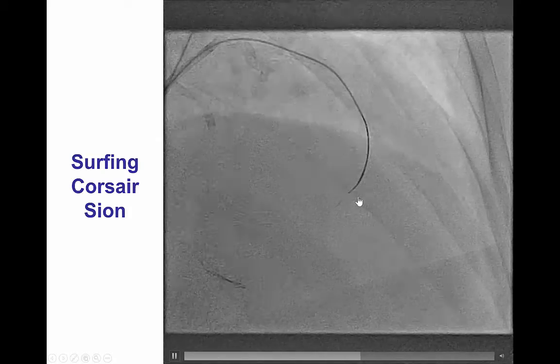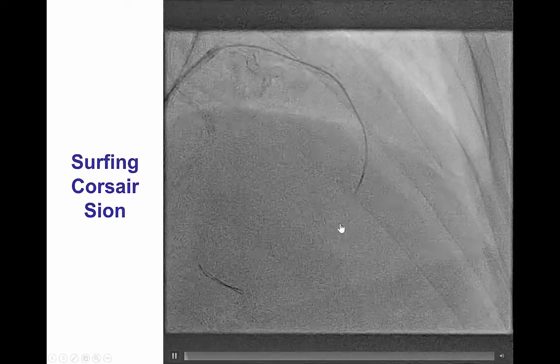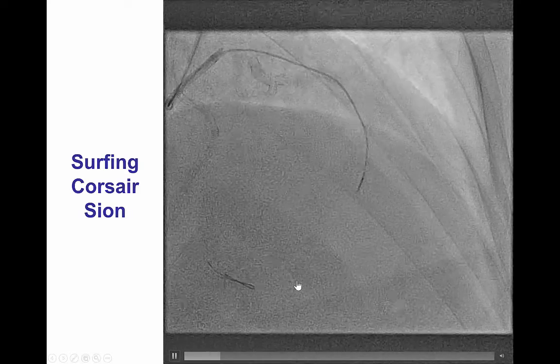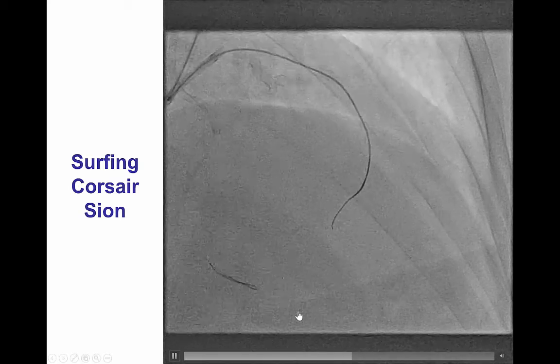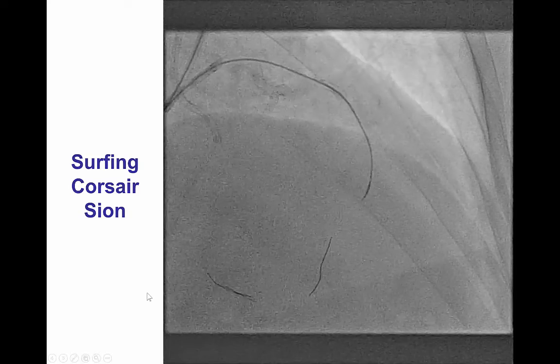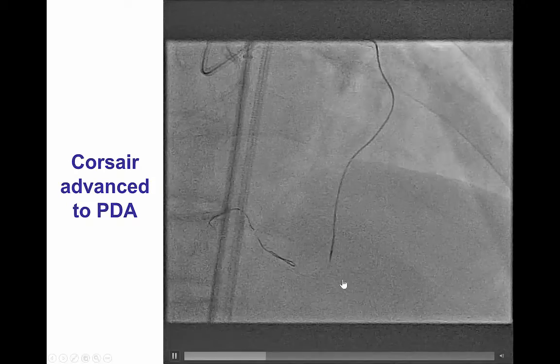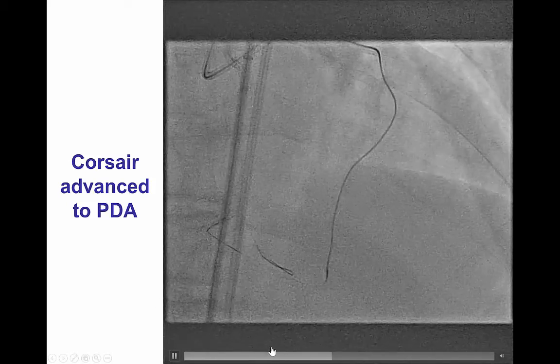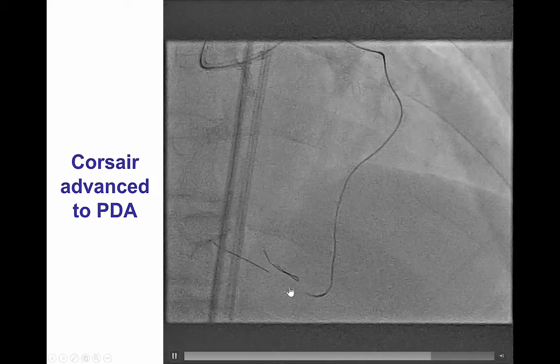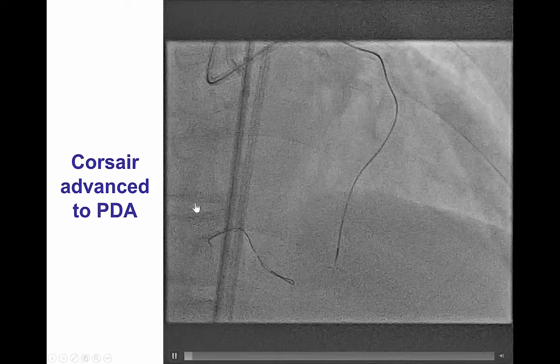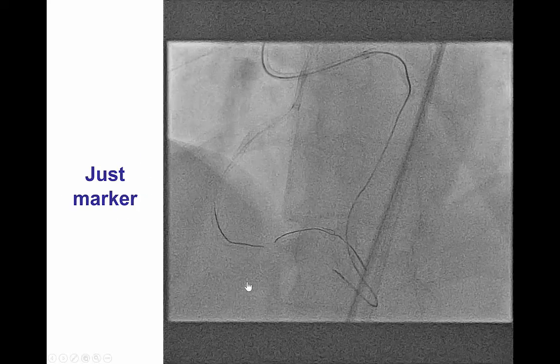This is an example of advancing through a Corsair microcatheter into the septal branch and easy crossing with a Sion guide wire all the way into the PDA. The Corsair was advanced into the right posterior descending artery with some difficulty — we had to push fairly hard, which caused the left main guide to back up — but we were able to advance it to the PDA.